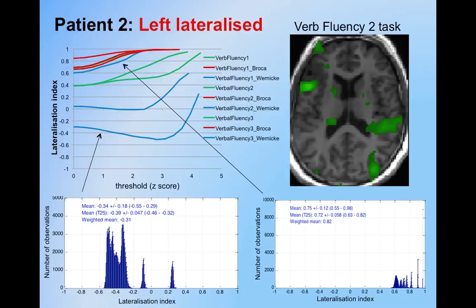So in a way we can say, well, maybe this one was just a bit of a spurious result, that effectively this curve down here was just a poor fMRI study. The patient may have been moving quite a lot or just not performing the task properly, which again gives us a bit more faith that we should be believing these ones, and these are the ones that we are sure were right because they tested that they were left lateralised during the surgery by this electrical stimulation.